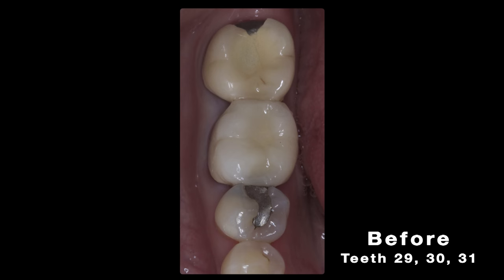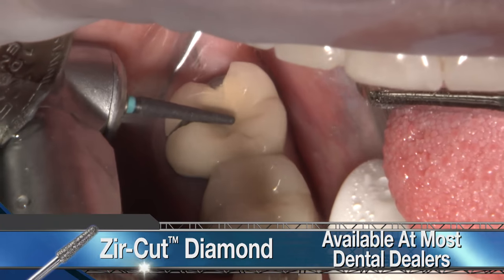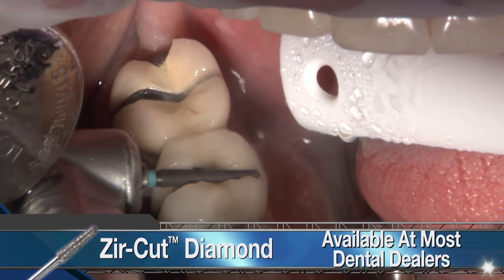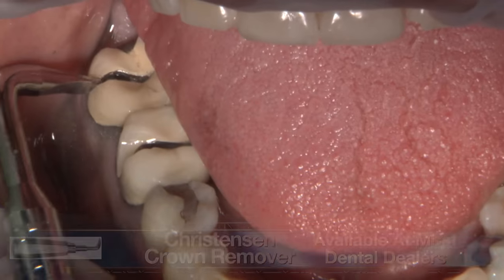We are moving now to the contralateral side to provide the second part of the treatment. Here is the lower right that had three defective restorations: a fractured porcelain on the distal of 31, marginal leakage under both PFMs, and recurring decay under the amalgam on number 29.